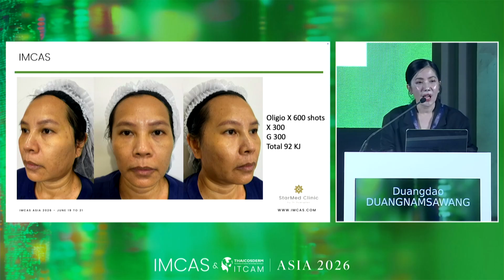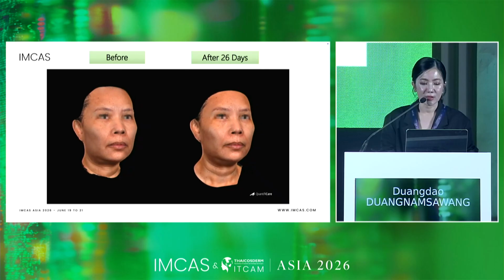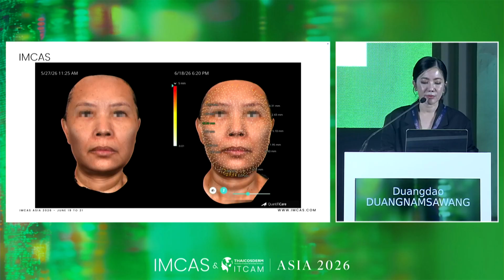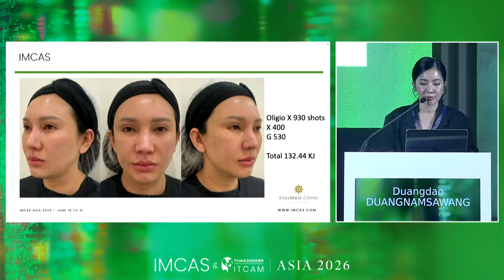The next case, after the example, I use only the moving technique. We see that improvement after 4 weeks. The lifting tissue and the volume loss. The next case uses high energy and more shot count.